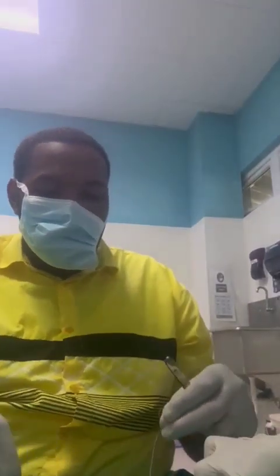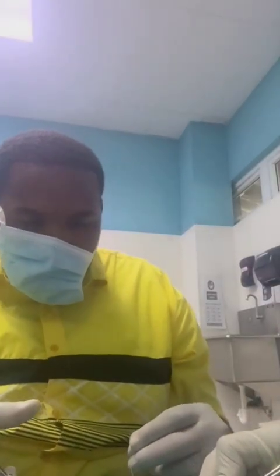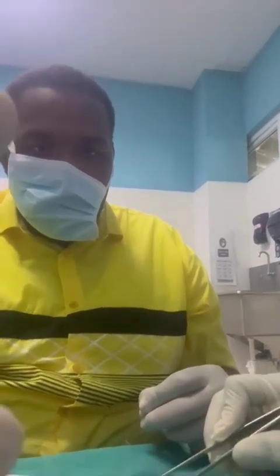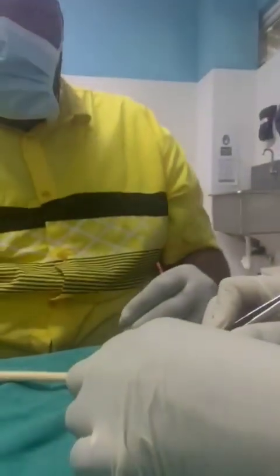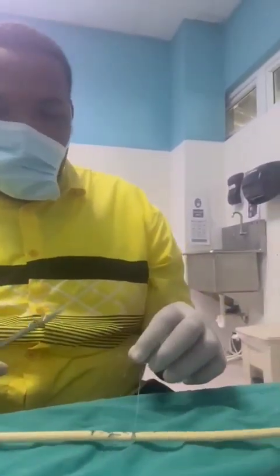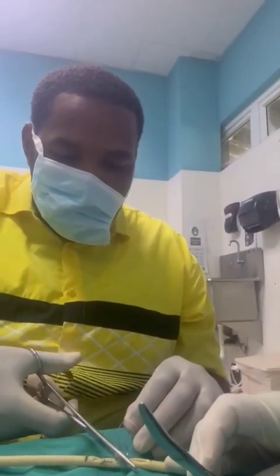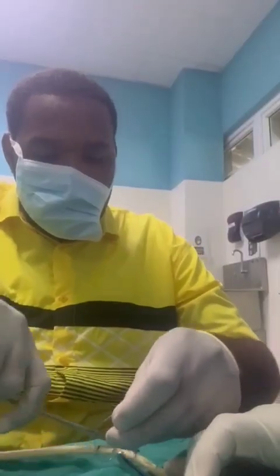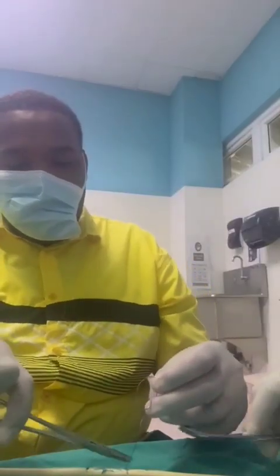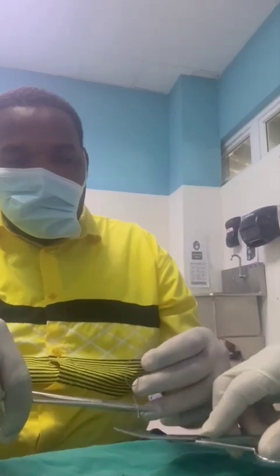Very good. Will it pull on? It has to be nice and flat before you make the final throw, because once you make that final throw, you won't be able to secure it any better. Okay. And then you go. Excellent, sir. And how would you like me to cut it for you now? 1 centimeter above the knot. Very good.